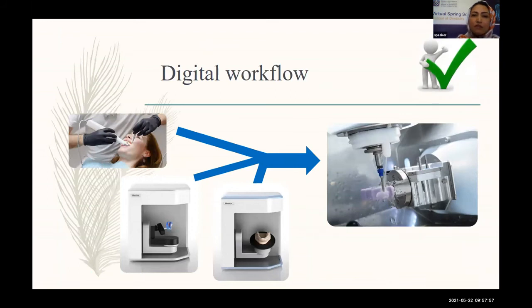Do you think that these considerations would be changed if we apply the digital workflow? Optical scanning demonstrates accuracy that is similar to traditional ones, even better. In particular, the dentist receives immediate feedback about their work, and it prevents additional appointments. In fact, tooth preparation principles are almost the same on both conventional and CAD/CAM cases. However, the CAD/CAM case preparation design must accommodate some considerations, like milling and scanning.